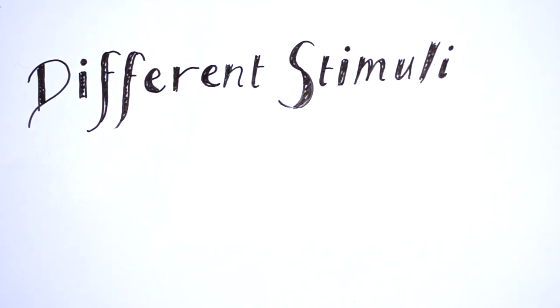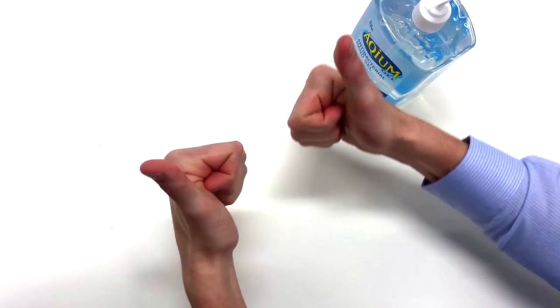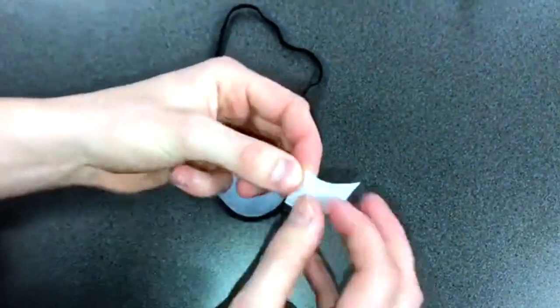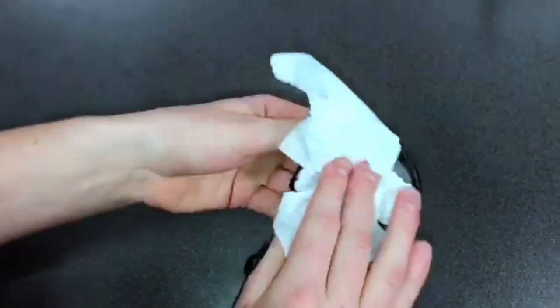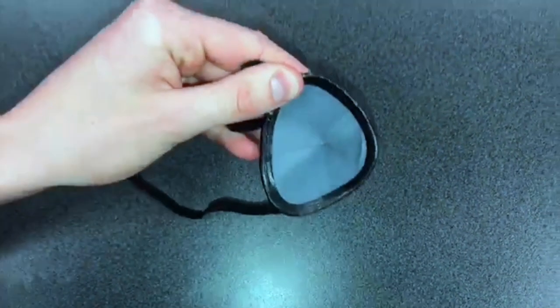Now let's watch an examiner and equipment setup. The examiner will begin by disinfecting their hands with antibacterial gel. They will then swab down the eye patch used to occlude the patient's eye with an alcohol wipe to ensure there is no cross-contamination from patient to patient use or contamination from surfaces.